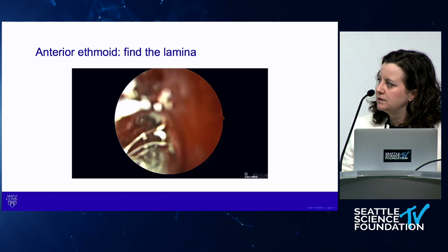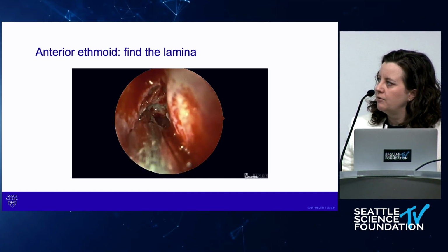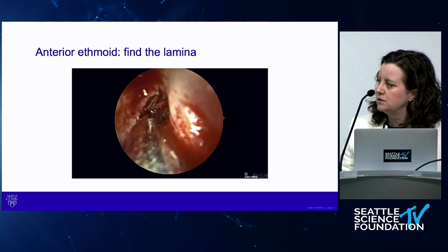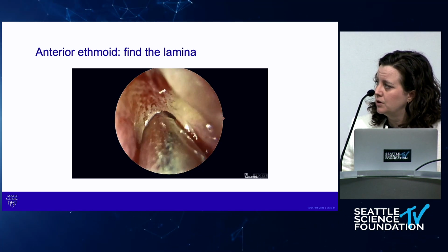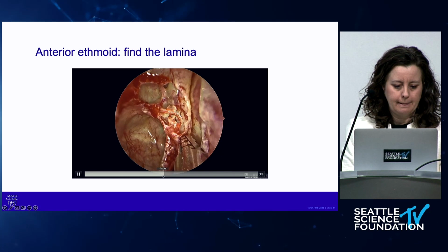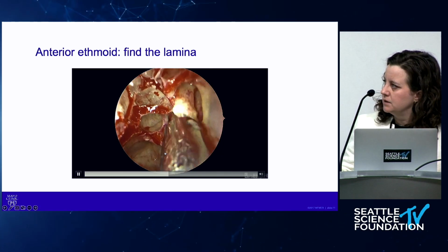I know the rule is don't use it near the eye, but I have my residents learn how to use the microdebrider everywhere so that they are safe using it. This is working on those anterior ethmoid cells. I am pointed towards the lamina, but I can always see the door. I'm not plunging in. We want to get this completely cleaned off. This person had a very extended maxillary sinus.